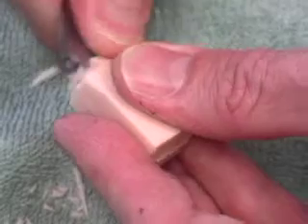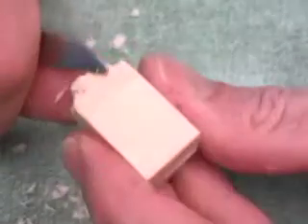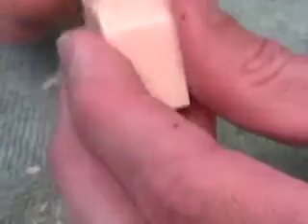We'll take off the corner. We'll take off, let's see, the mesial corner. And now we're going to narrow it up at the gum line.